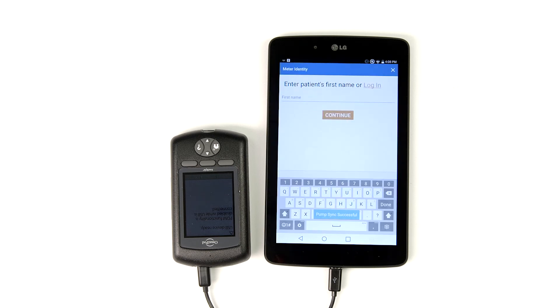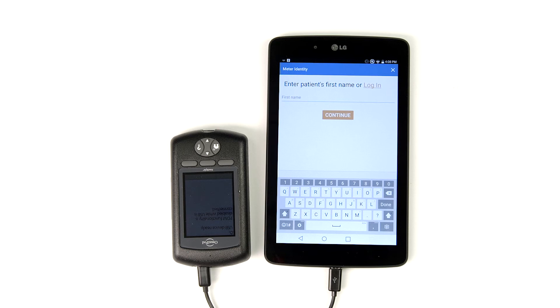Once the data file is transferred, you'll notice a short message at the bottom of the screen. It reads, Pump Sync Successful.